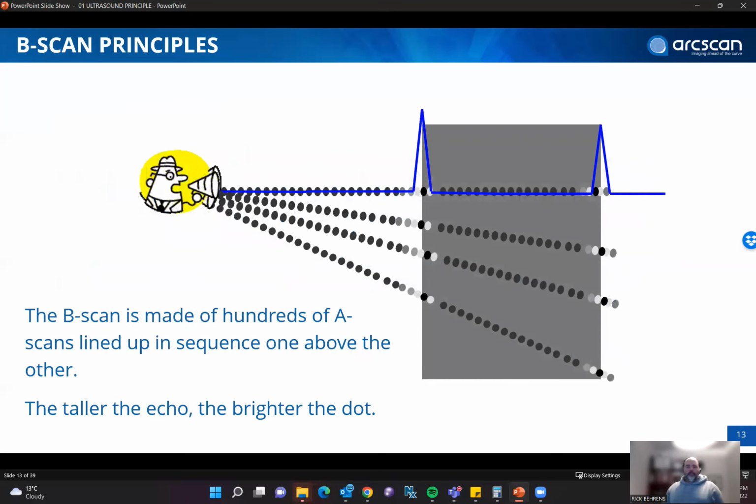Every time it finds a peak, it's going to give you a white image. Sadly, that square is wrong because it's showing you a black dot, which it shouldn't. A taller peak will show as white, and if there's none, it will be black.